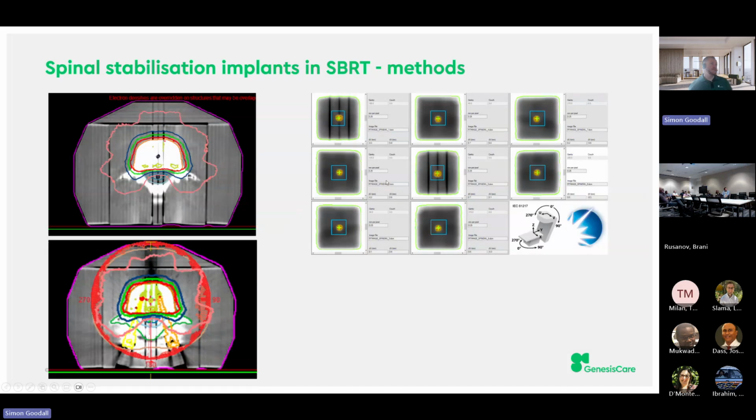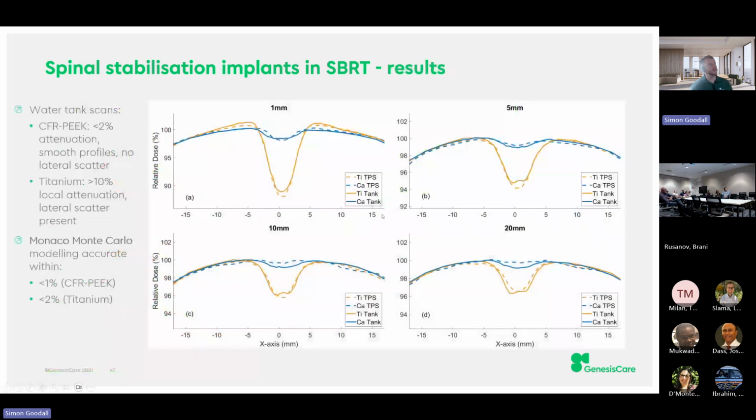So the two things that we evaluated were end-to-end dosimetry in this case. So we generated some treatment plans and measured them with ionization chambers and with film. And we also looked at the localization accuracy. So we positioned the phantom using our clinical workflow and then evaluated whether a ball bearing had been put correctly at isocenter using a Winston-Lutz test and this PIPS Pro software.